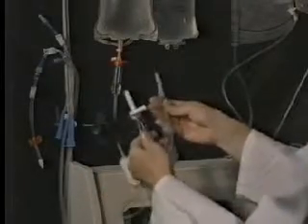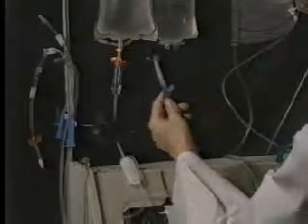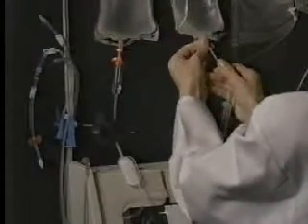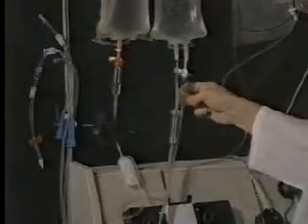Next, connect the access and return saline lines to the same saline container. Using aseptic technique, clean the injection port before inserting the metal spike into it. Then place the plastic spike in the spike port. Fill the drip chambers 1/2 full.